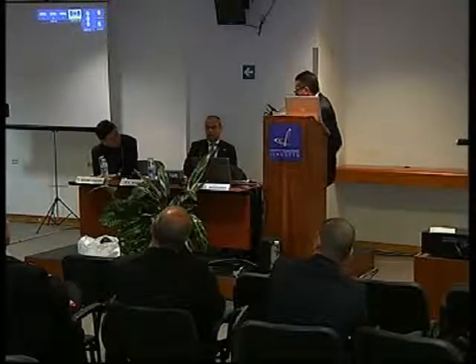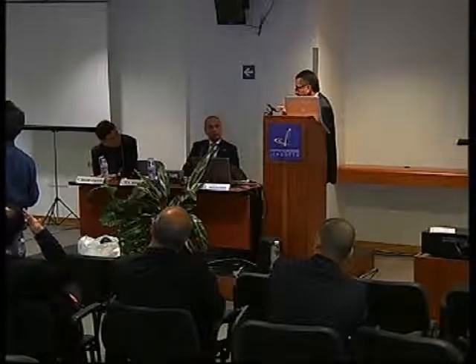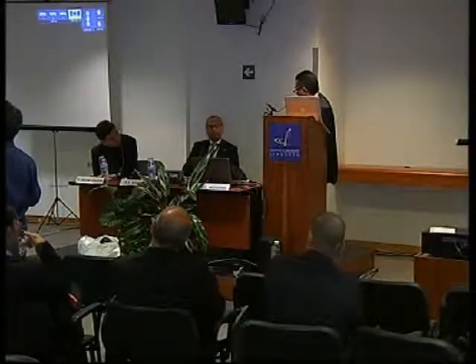So the concept of rigidity of the fistula scope is patented because it is wanted, it's necessary. It's necessary because when you enter with the fistula scope you can put your finger inside the anus, and this maneuver allows you to go straight to the fistula, okay? Like when you perform a colonoscopy. The fistula goes straight. This is a very important concept.